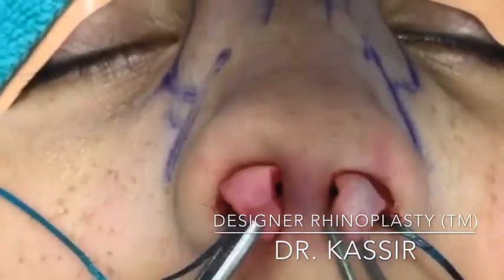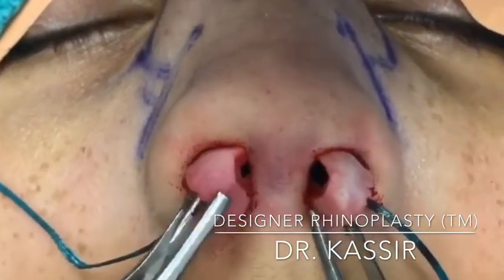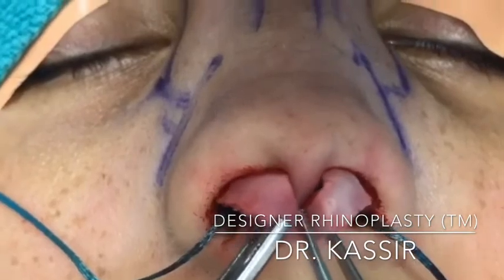Here are the lower lateral cartilages that have been delivered, and we're going to contour them, narrow them to give this nose shape.